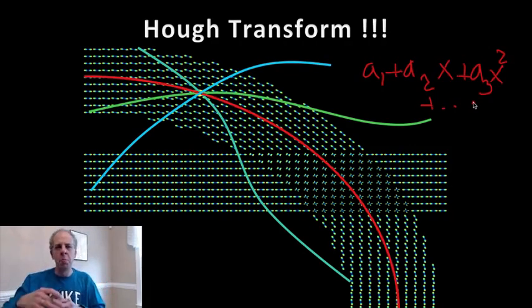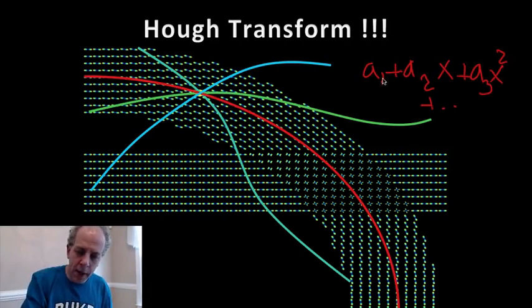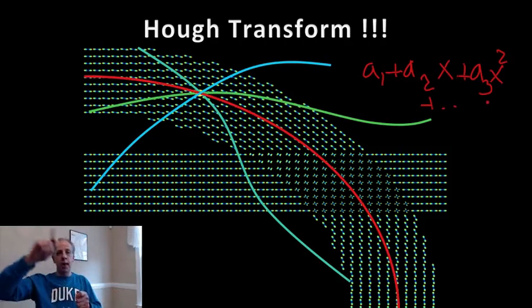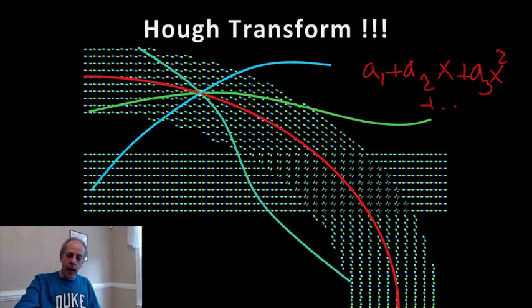Maybe you go up to 6 exponential seventh, and then the Hough transform is going to vote for these coefficients. Remember, the Hough transform is great when we have parameterized curves. And here, I'm going to just parameterize a curve by basically this function, and x is just the coordinates in x, y, z in 3 dimensions. So these are kind of vectors. Now, how do you do the voting?